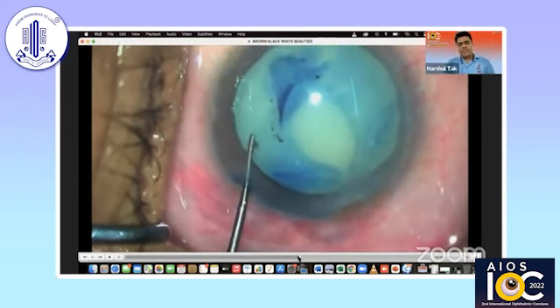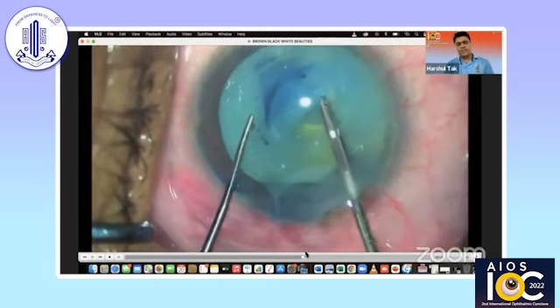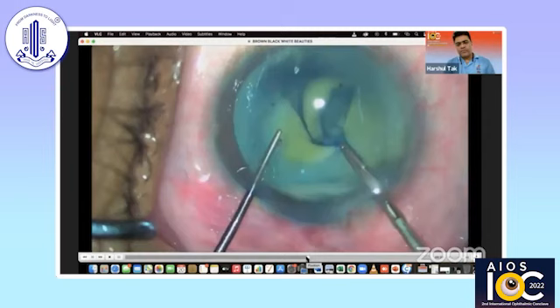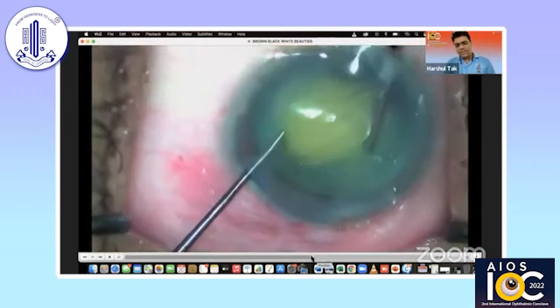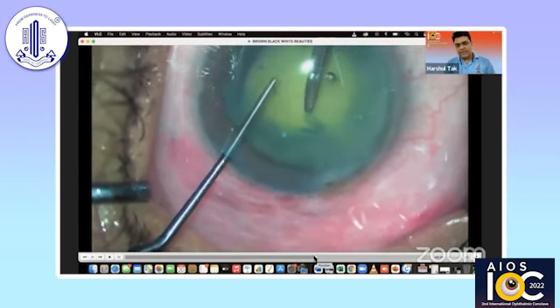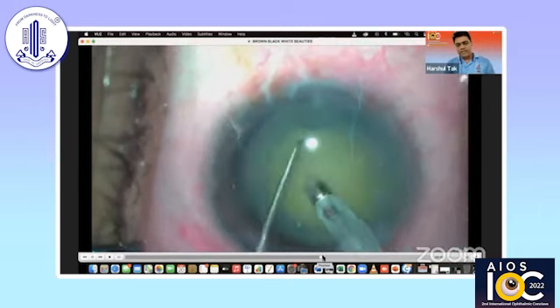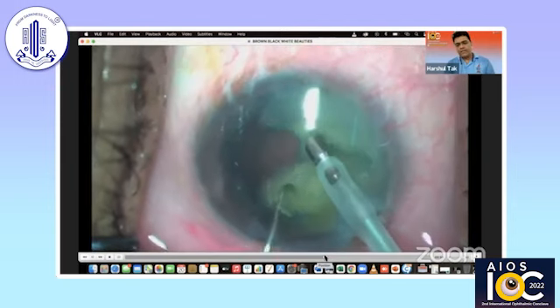Coming to another kind of white cataract — the Morgagnian cataract. The problem here is not increased intracapsular pressure, but the zonules are weak. You can see the anterior capsular plaque, and the capsular bag is very weak. You need to take off the liquefied cortical matter from your view and create the capsulorrhexis. Here I realize that the capsulorrhexis is small in size, so I go ahead and give a snip from the other side and make a capsulorrhexis of adequate size. The next challenge in Morgagnian cataract is how to chop the nucleus, because the nucleus here is very mobile — there is no cortical cushion.